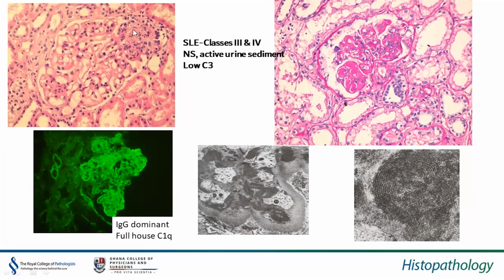I think there's also some necrotizing lesions, because you see this fluffy pink material, which could be fibrin, and these blue dots here, which look like karyorrhexis because of fibrinoid, which can be seen. This is nuclear dust, damaged nuclei, that is seen in a case of severe lupus nephritis.